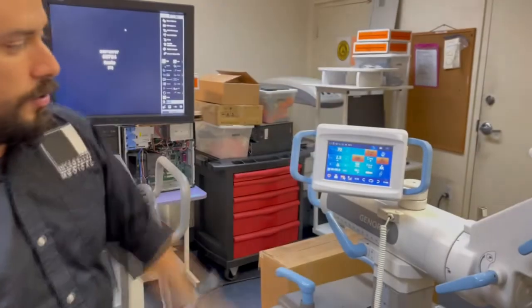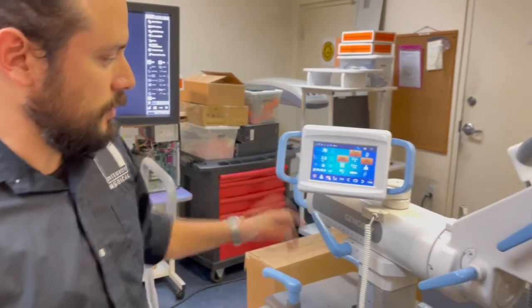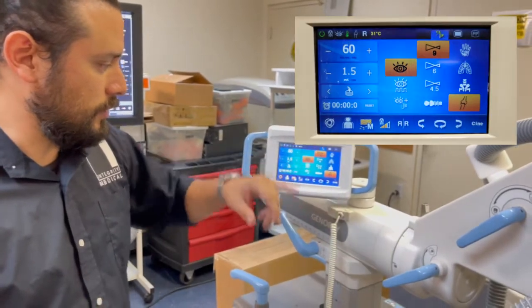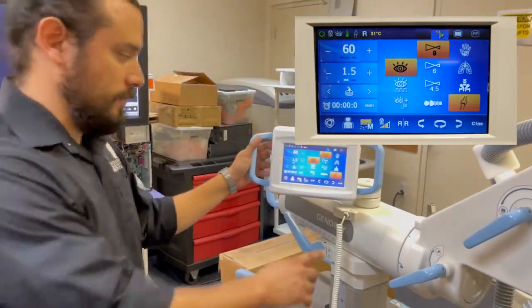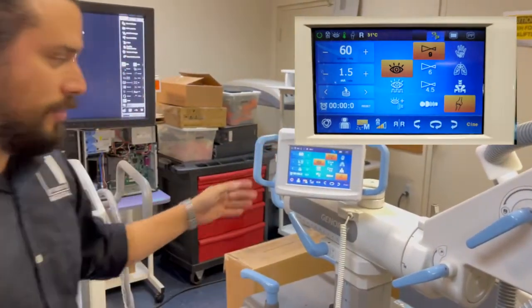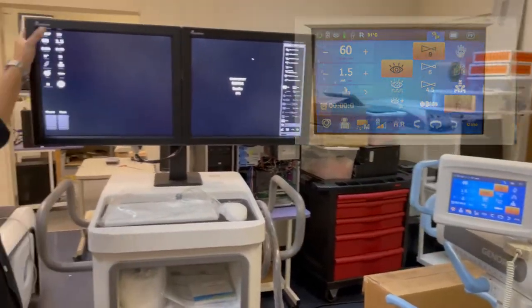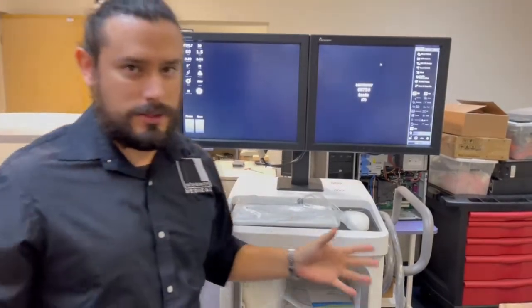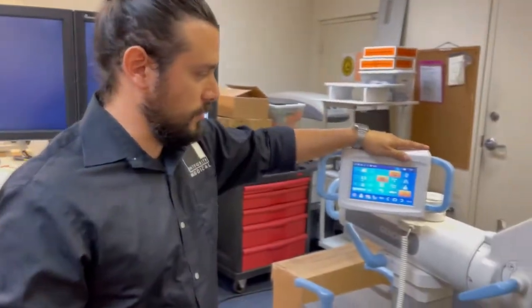We're going to take a look at an orthopedic version — these are going to be our options. We also have Cine at 30 frames per second. Unfortunately, no digital subtraction, but again, this is just for orthopedic use.